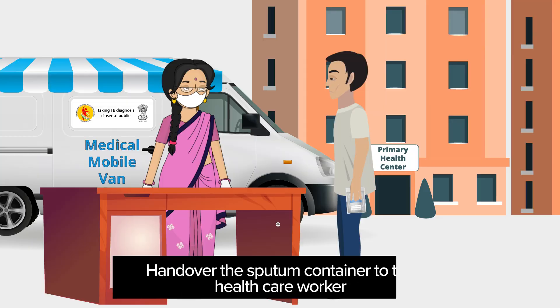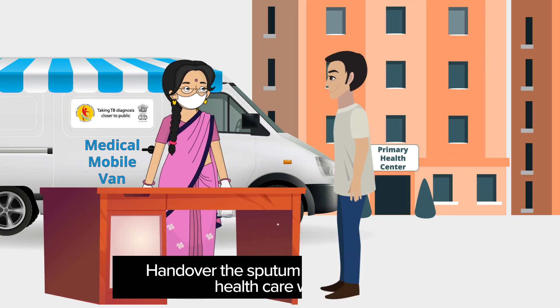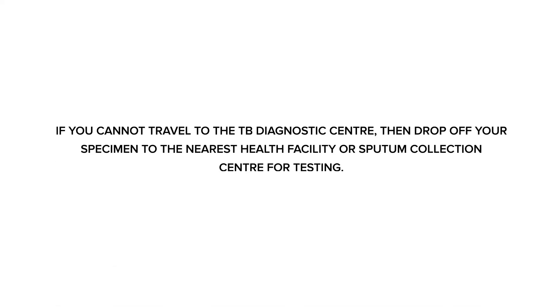Then hand over the sputum container to the healthcare worker. If you cannot travel to the TB diagnostic center, then drop off your specimen to the nearest health facility or sputum collection center for testing.